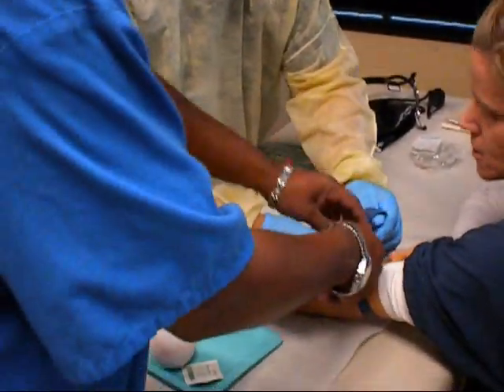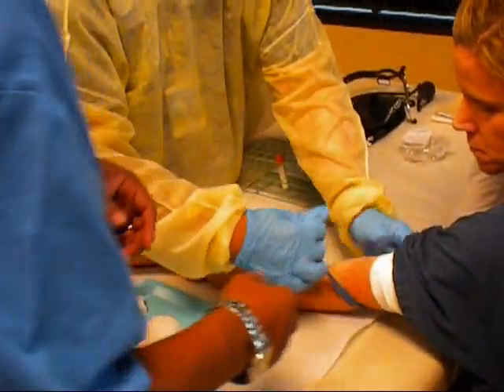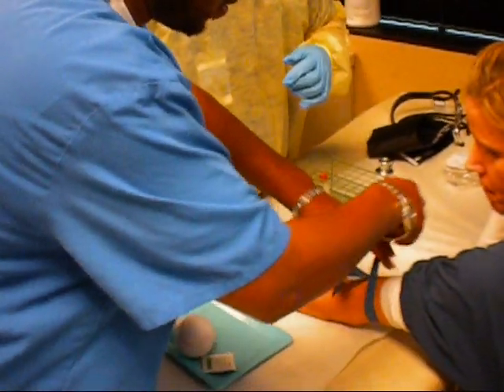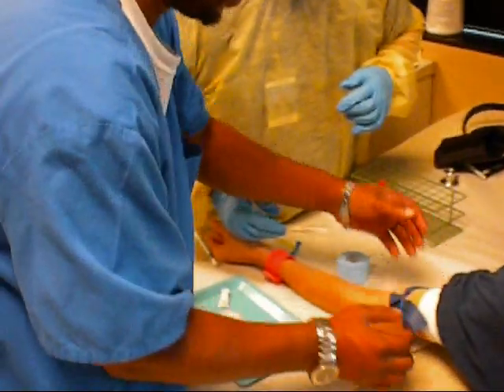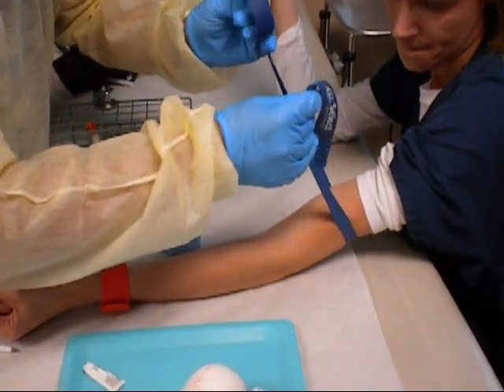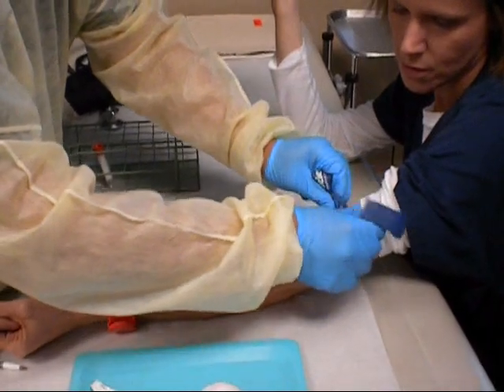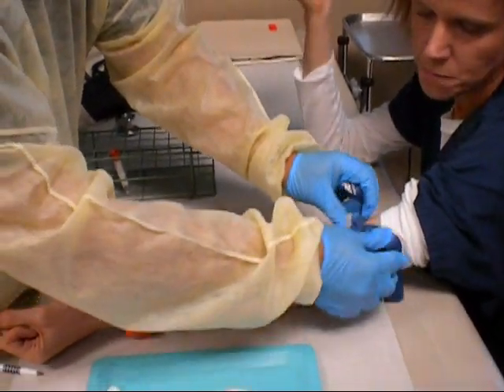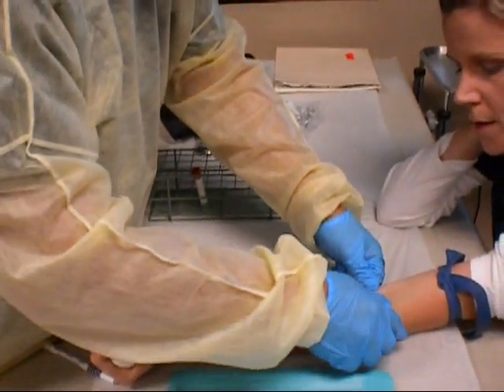You want to make it — you don't want to tie it that way. Because if you tie it this way, you're not going to be able to get that off. So what you want to do is kind of tie it out so that way — you cross over it. Instead of going all the way through it, you're just going to tie it that way and then that way. You want to make sure it's tight. So you want to kind of pull up. There you go. And then you're going to tuck. Now I'll take this little squeezy thing and pump it up for you.